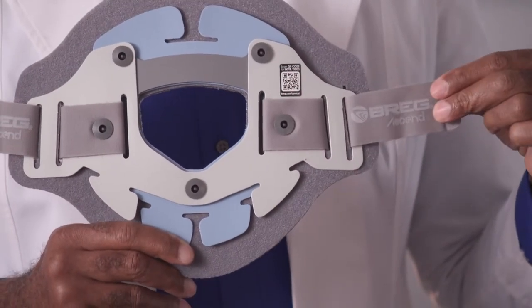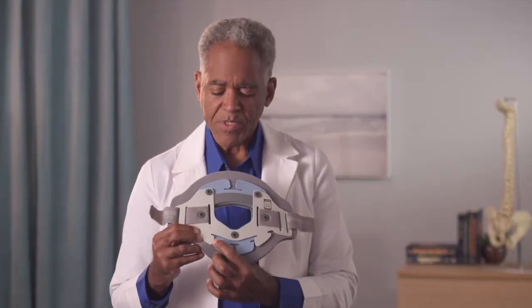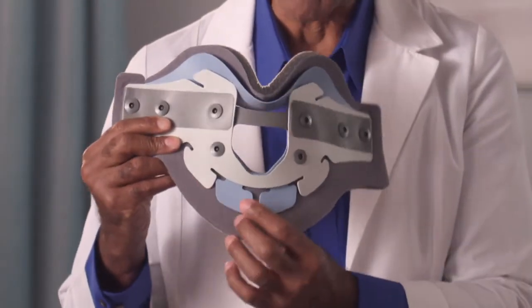The logo on the strap should also have the words properly oriented when applied. Confirm the flexible tabs are below the cutout in the middle of the plate. On the anterior plate, the flexible tabs should be below the tracheal opening.